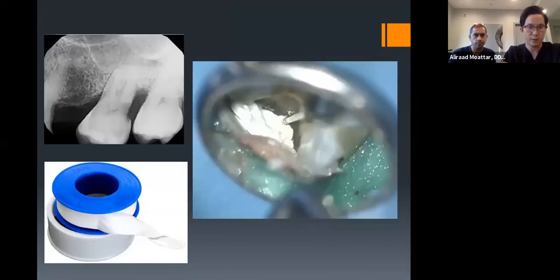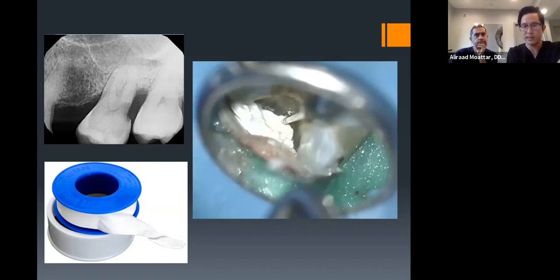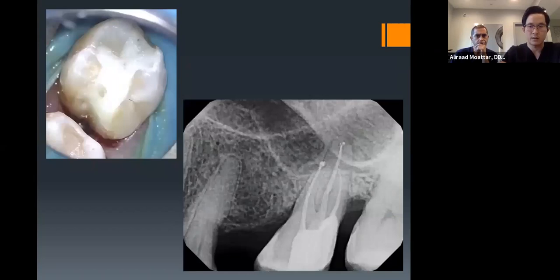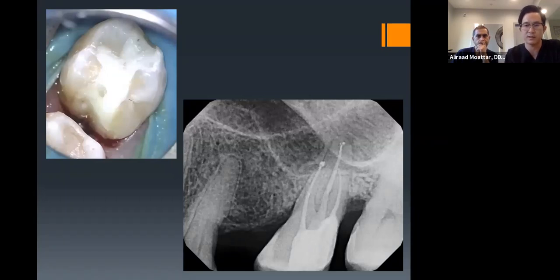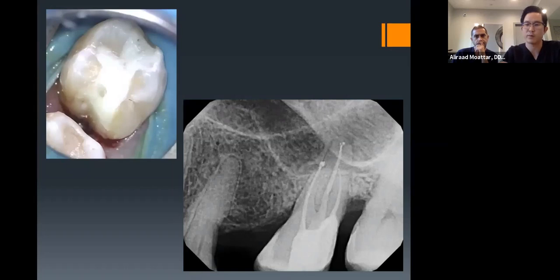Another copper band case: upper right first molar with deep distal-buccal decay. Used a copper band, packed teflon tape in the gaps to seal them — teflon tape is very useful for wedging and packing to seal gaps. Fluted the margin to mimic the natural contour of the tooth. The final result: with a meticulously isolated seal and no leakage, very confident in the bonding — comfortable placing a margin onto resin composite. This is a deep margin elevation case.